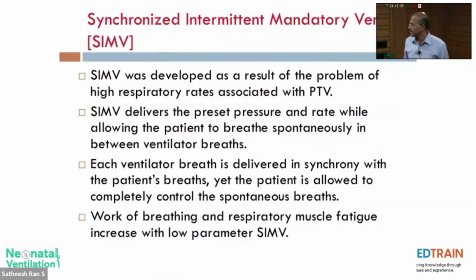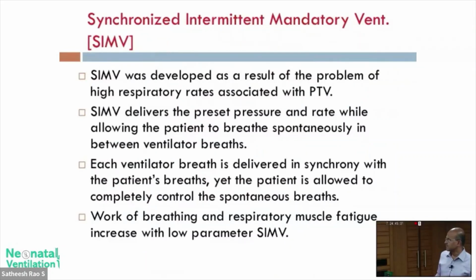In SIMV, it was developed as a result of the problem with high respiratory rate in PTV, and it delivers a preset pressure and rate while allowing the baby to breathe spontaneously. So the breaths that the baby takes in between the set rate are supported by the baby's own effort.